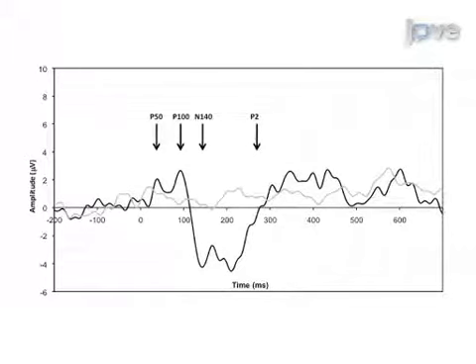to light touch. So the main advantage of this method compared to some other methods like MRI or electrical nerve stimulation is that it's very child-friendly. It's fast, it's painless, and it does not require active participation, which allows us to do it both in infants and in young children.